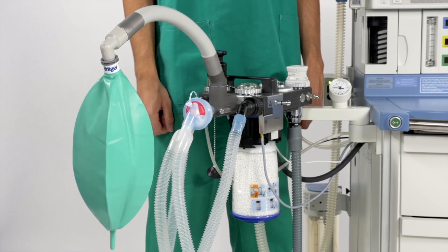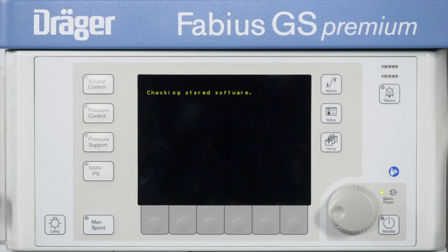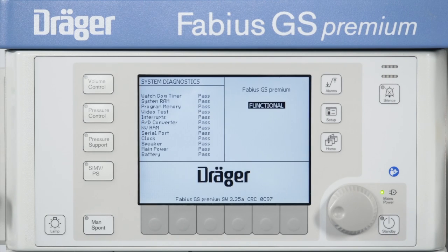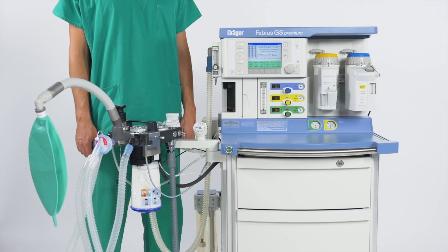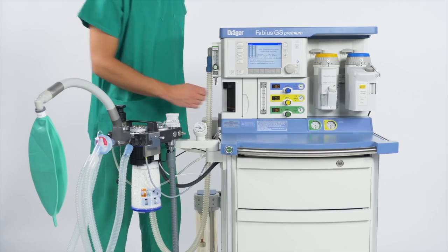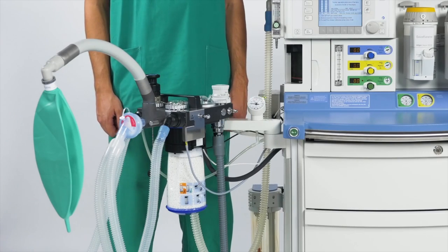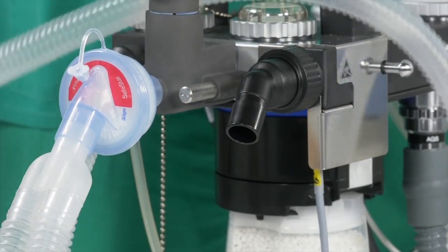A critical difference in pressure control that may explain the difference in tolerability lies in the ability of pressure-controlled ventilation to maintain a constant airway pressure by varying the inspiratory flow according to the needs of the patient. Although pressure control has shown improvement in ventilator timing, some results can be seen on the ventilator display indicating that adjustments are needed to continue to maintain optimal conditions. Both types of ventilation control offer some advantages based on better parameter control in the volume-controlled modes and better patient adaptation in the case of pressure-controlled modes.